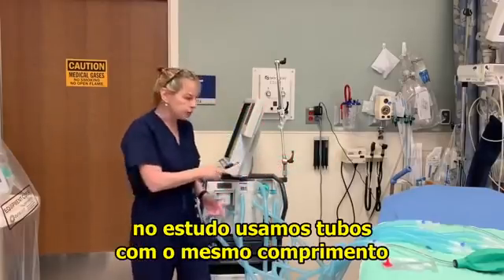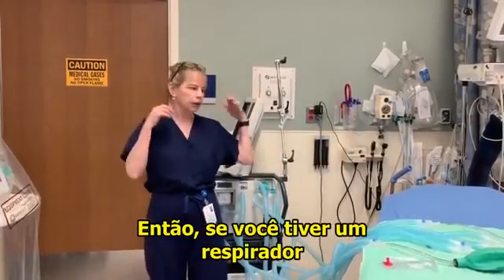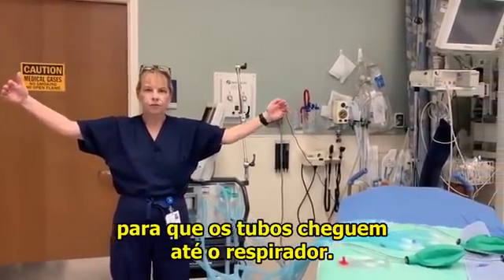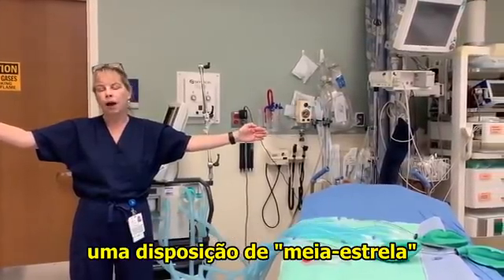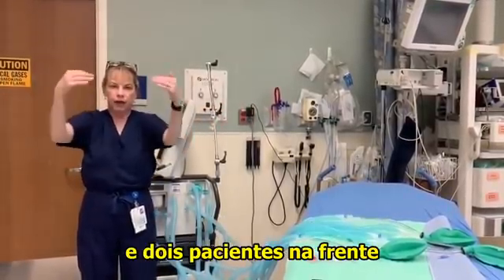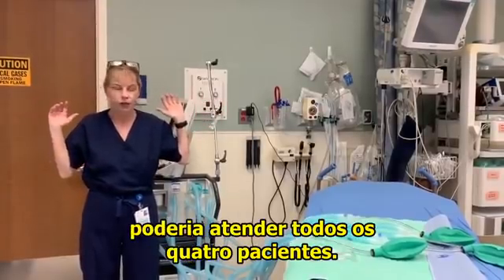Additionally, in the study we used the same length tubing for all four test lungs. So if you had one ventilator with four patients in a row, the patients on the outside might need extenders to have the tubes reach the ventilator. For that reason, I would suggest what I call a half-star configuration — with the ventilator in the middle, two patients on either side with heads facing the ventilator, and two patients in front with heads facing the ventilator, so the same length tubing can reach all four patients.